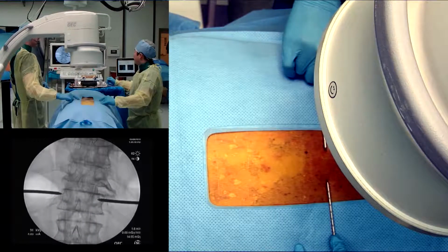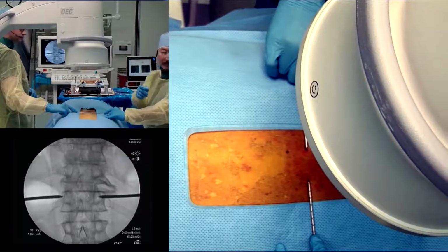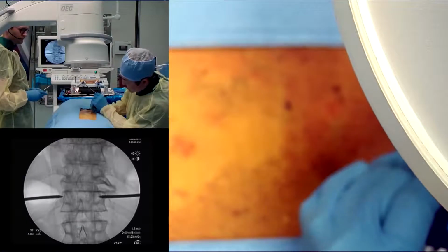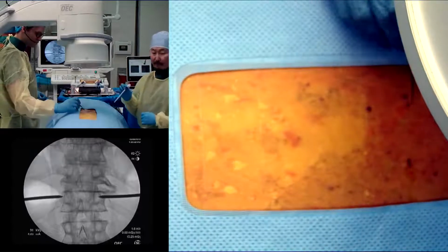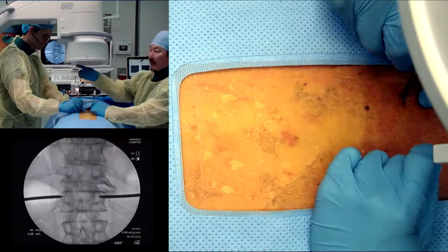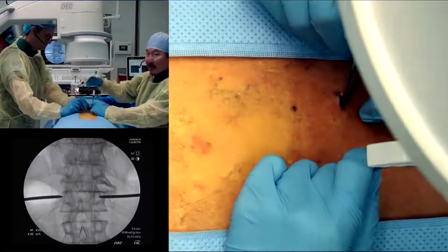Can you straighten that up and down? And then go ahead and picture that. Do I have a knife? I like to make transverse incisions just through the skin. It's kind of dull. Here you go. And then we're going to need Kochers times two. And what we're trying to envision is, some of the C-arms actually have a laser. The laser goes from center to center, and so what we try to do is match that angulation.